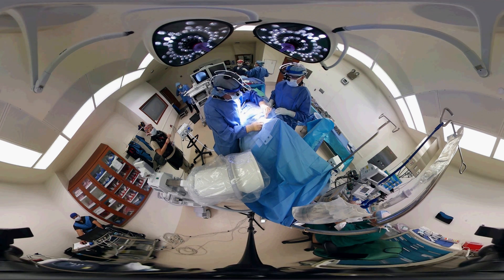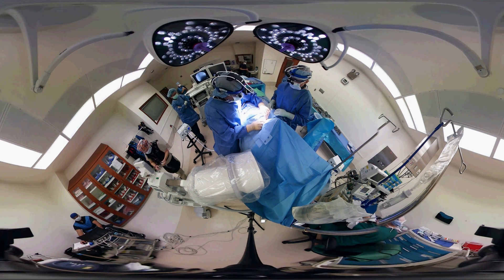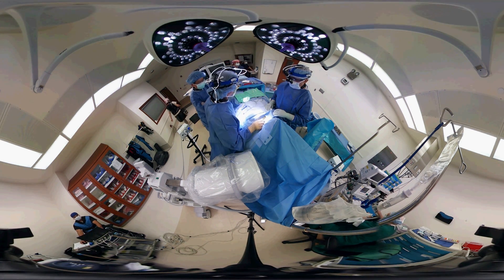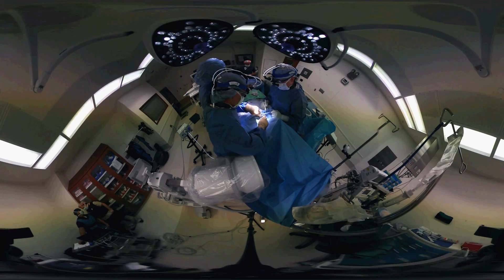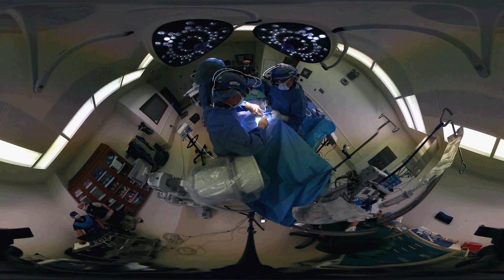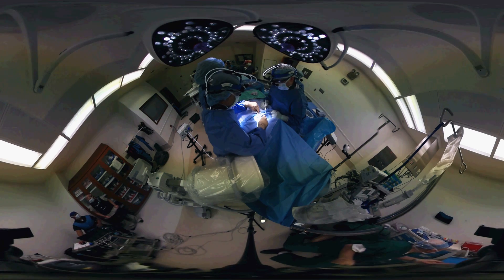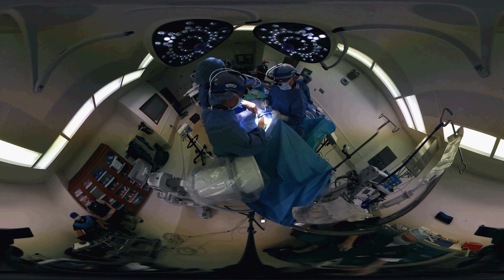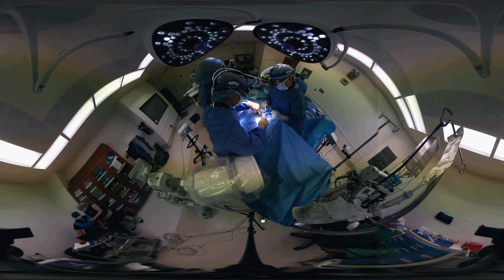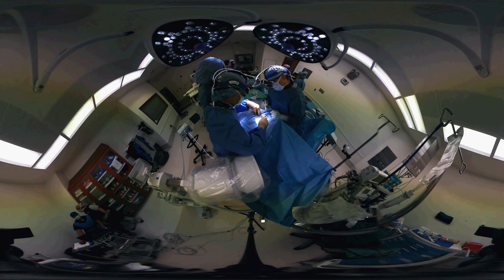Right now we are doing the approach. I'm making the skin incision, which is just a small two centimeter to two and a half centimeter incision — really just about one inch or less. Now you can see me actually dissecting deep until we get to the front of the spine. The nice thing about cervical disc replacement surgery is that it is a relatively bloodless procedure in that all we do is follow the normal natural tissue planes of the body, meaning we separate the tissue planes — we don't really cut anything.